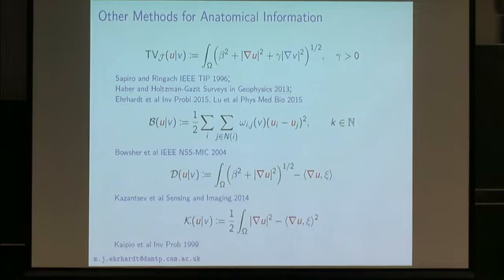So one thing is what people call joint total variation. This now depends on the magnitude of the MR gradient and not the direction anymore directly. And what it does is, when the magnitude of the MR image is large, then we do not penalize the PET image so much anymore. So in a certain sense, it incorporates the locality information from MR into PET.